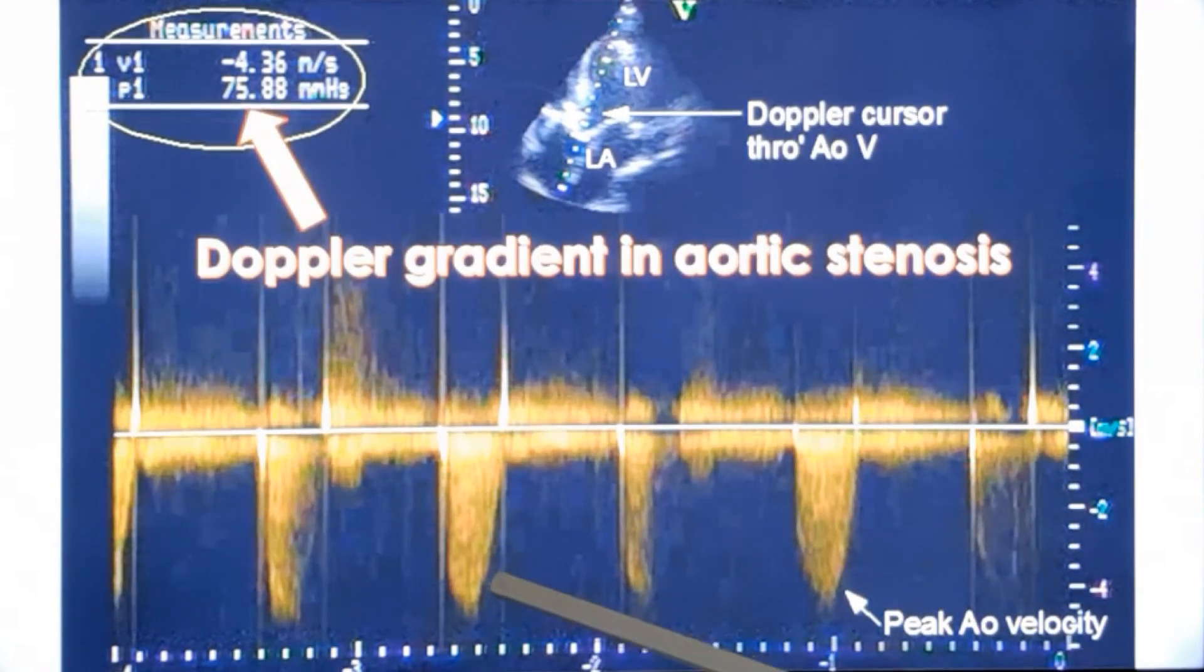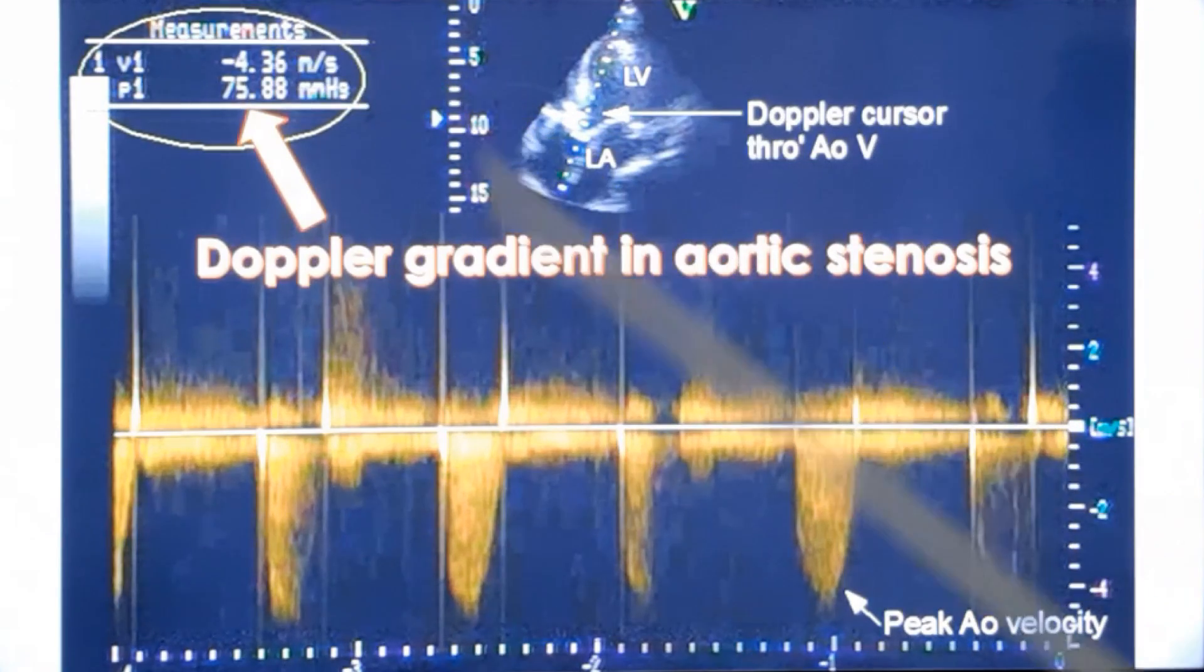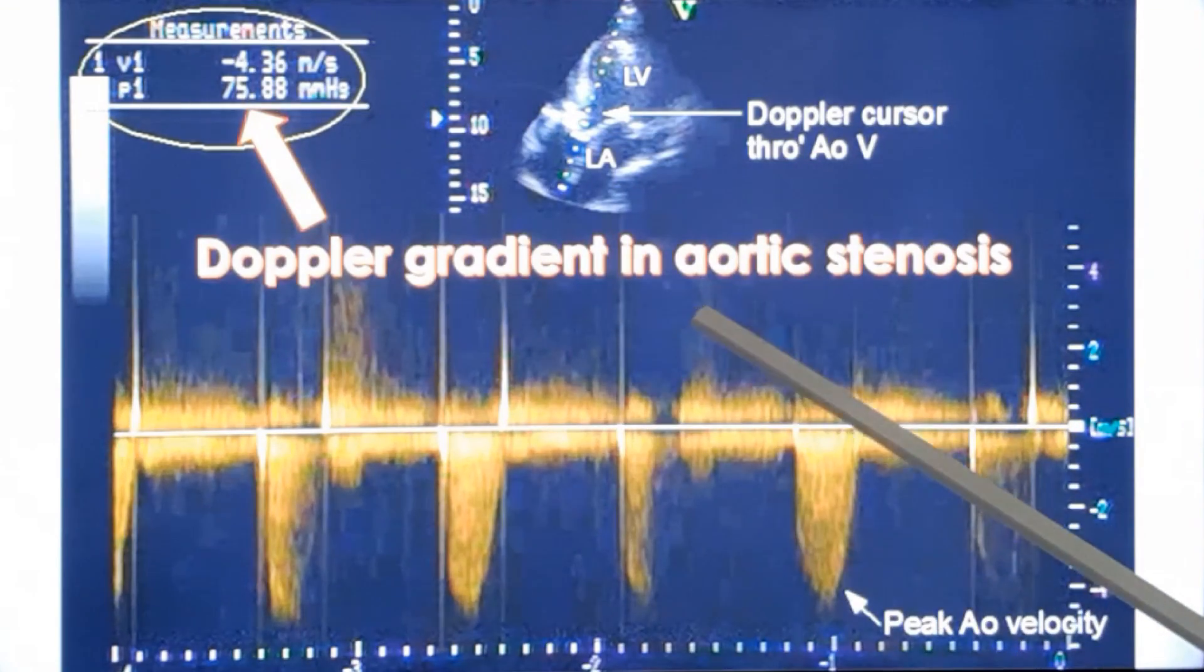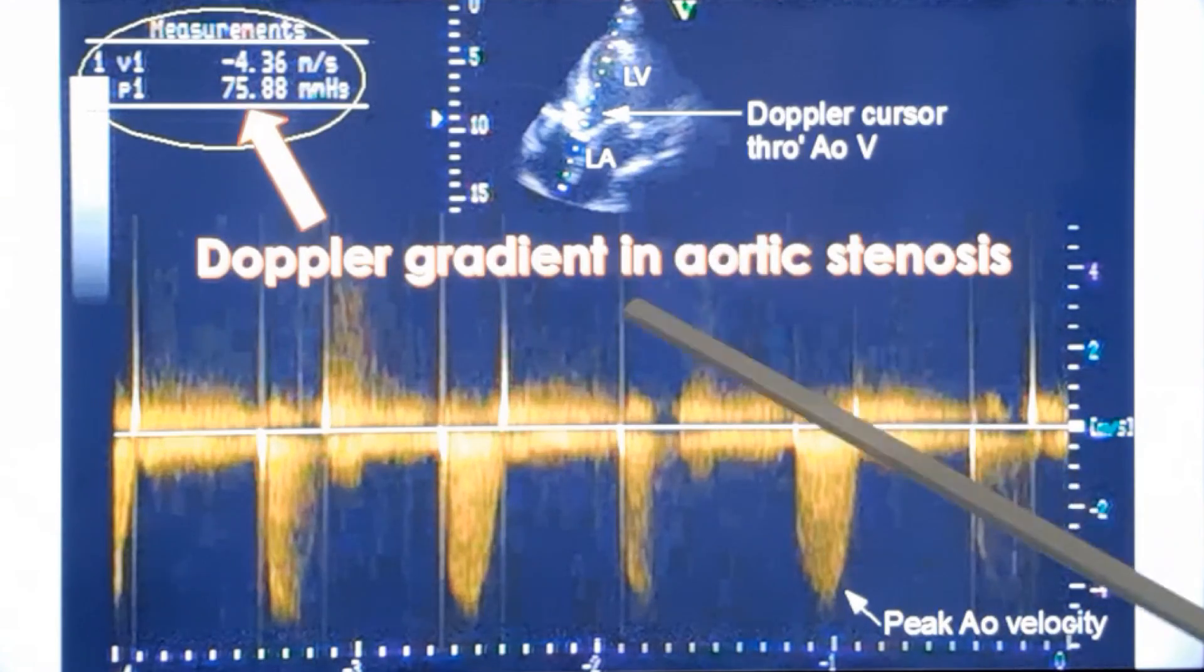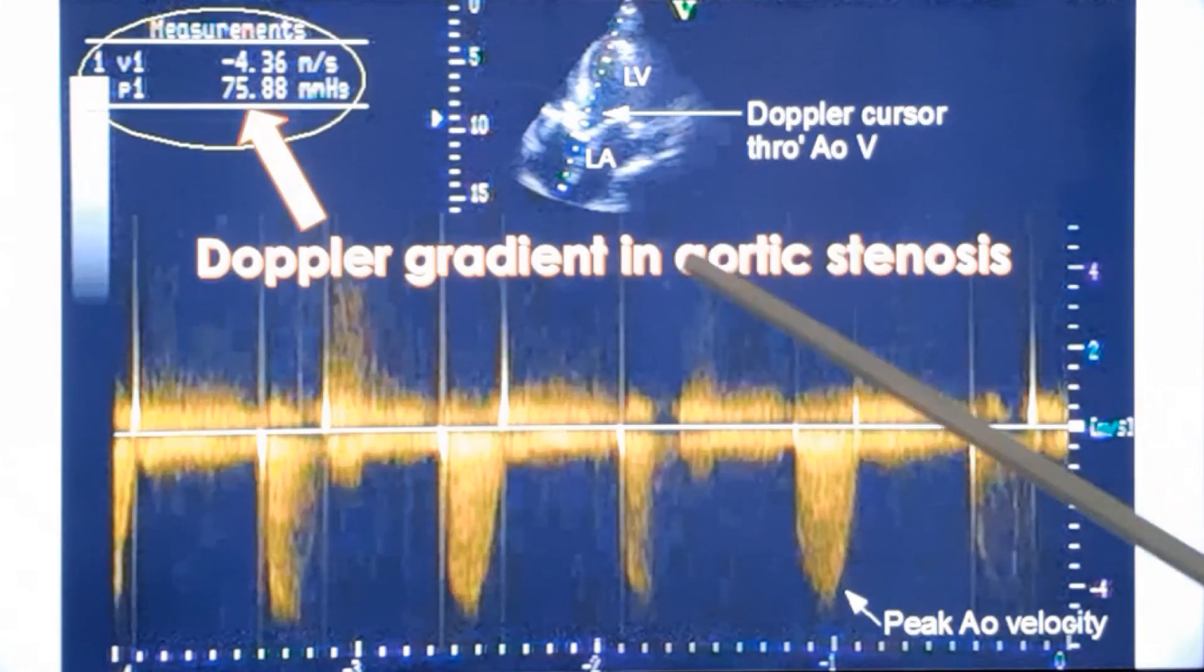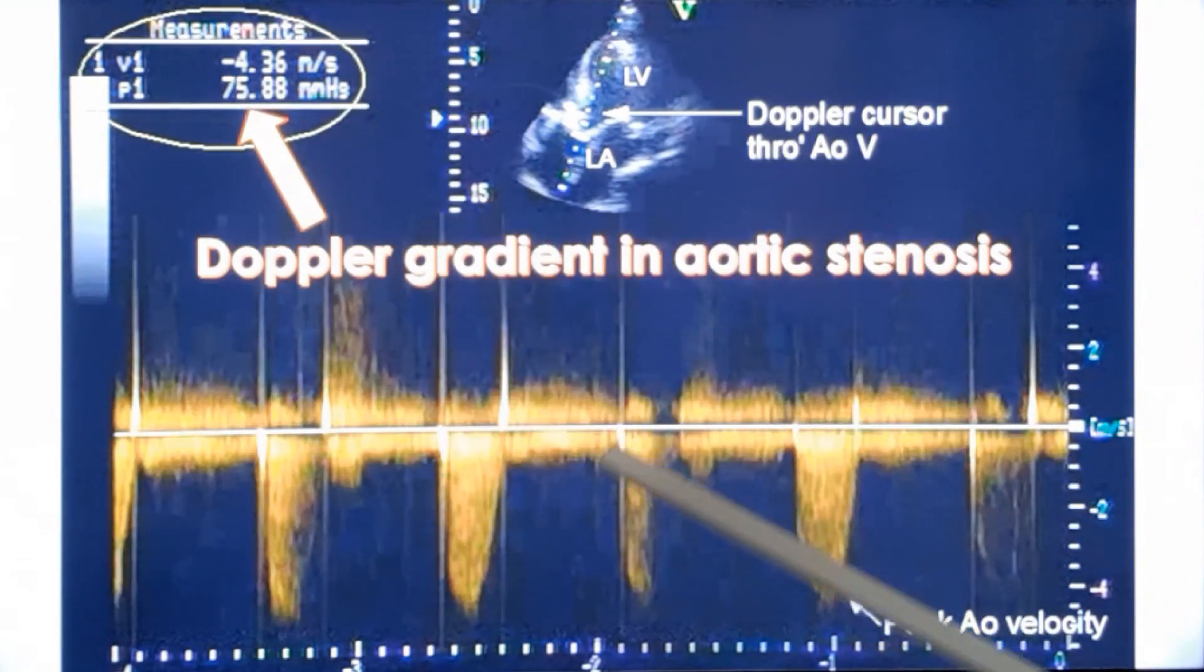As I mentioned earlier, this is the peak instantaneous gradient calculated from the peak aortic velocity. Aortic velocity is shown here, and by the formula 4v squared, you get the peak gradient. But here you don't have to calculate. The echocardiograph calculates it for you once you show the peak velocity to the machine.